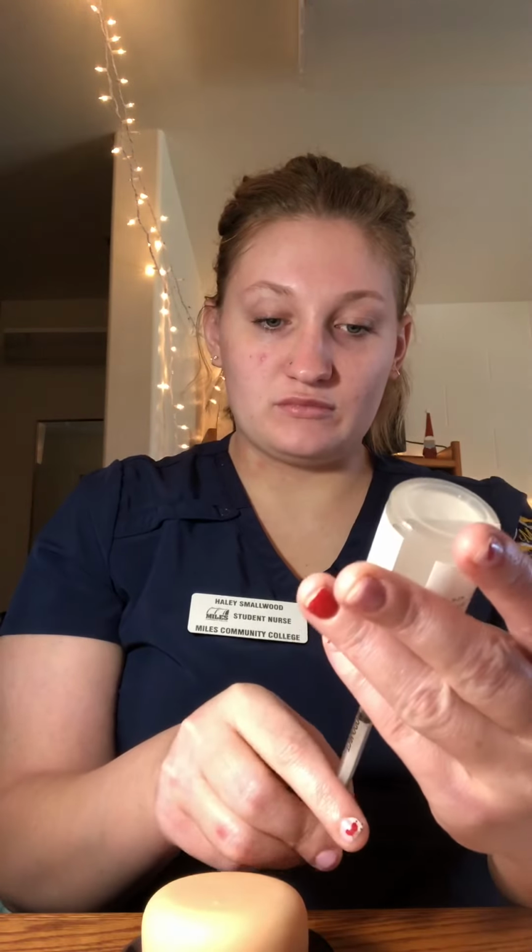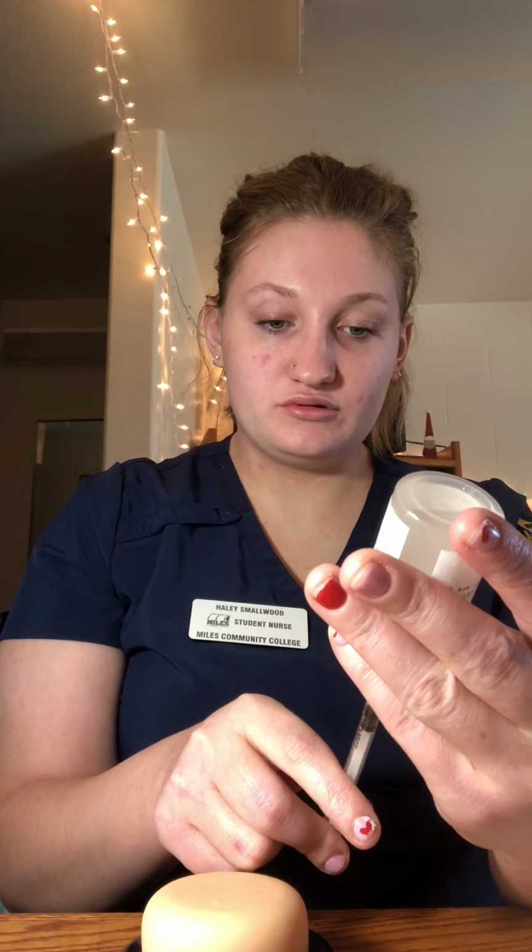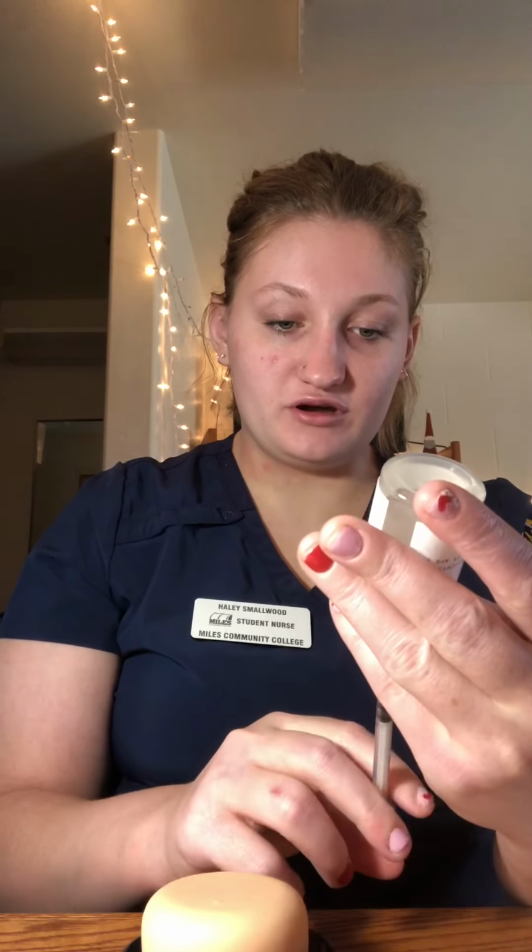And you want to pull back 0.1 mL to keep it sterile. And this is just air into the vial. And then you want to pull back that medication.